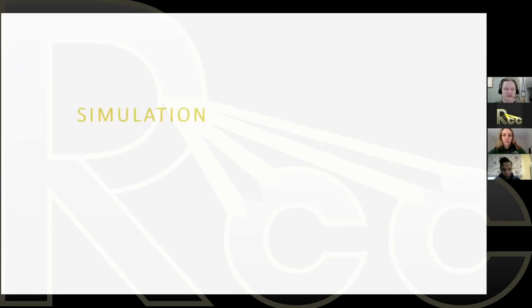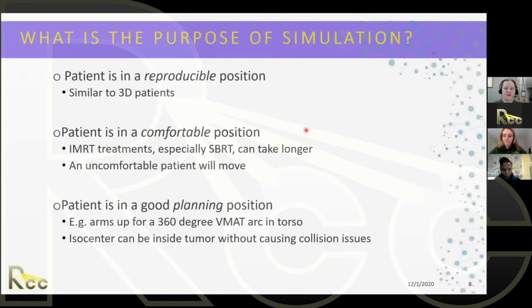So once you have your CT scanner commissioned and you've run through all of these tests for the first time, you're ready to simulate the patients. So what is the purpose of doing this? First of all, we want the patient in a reproducible position, and that is very similar to our 3D patients. Because you need to reproduce the position 30 times sometimes, and it needs to be the same on simulation day as on treatment day, it is important to make really sure that the patient is straight, the spinal column is aligned sagittally, and the patient is not rotated on the couch or in a funny position that would be hard to get into.